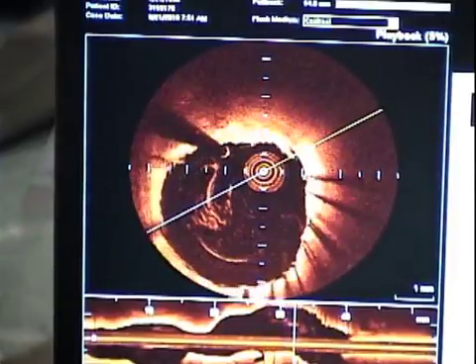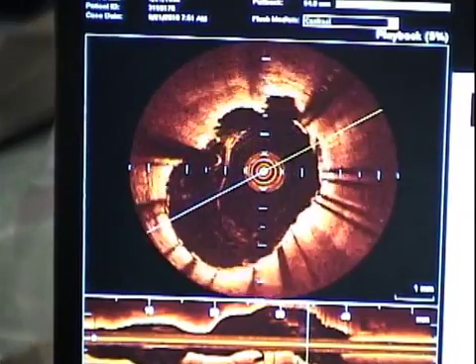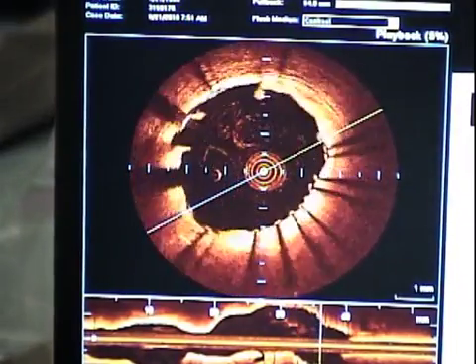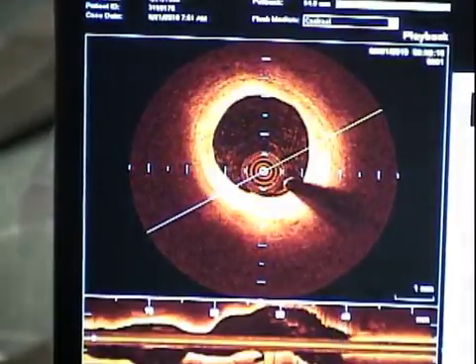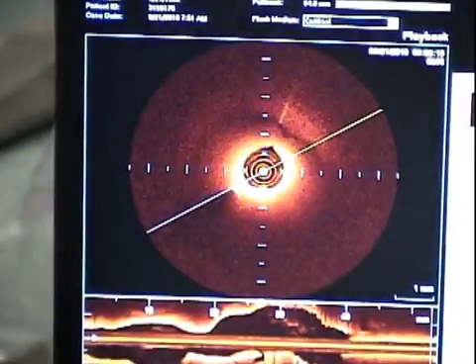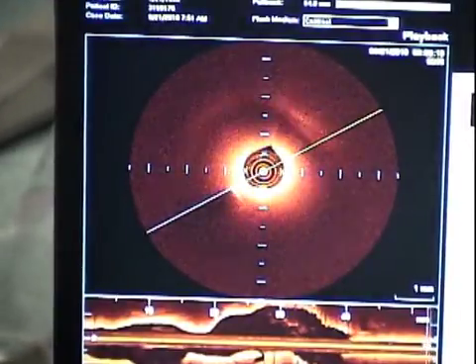So, another. Okay, now you start seeing the... I think it's a good, yeah. Yeah. Well, and we can stop at that area where we see the stents. Go back. Can we take this one out on floor so that we do the IVUS? Show at that area of the stents.